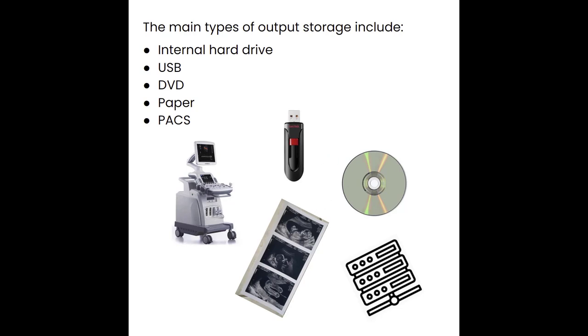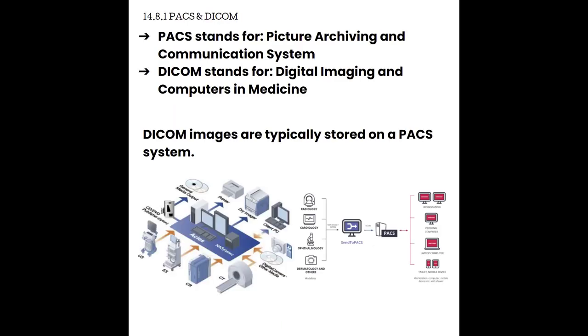So let's take a closer look at what it means to use the PACS system. PACS is an acronym. PACS stands for Picture Archiving and Communication System. PACS is a place where images and other medical information go to be digitized and then stored, typically on a really large computer network. And having a PACS system is super helpful. It has a lot of advantages.